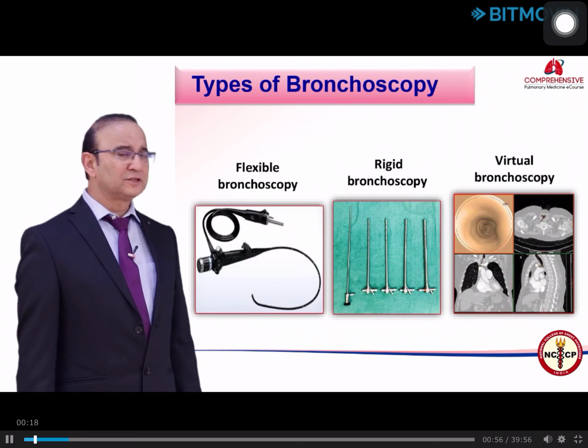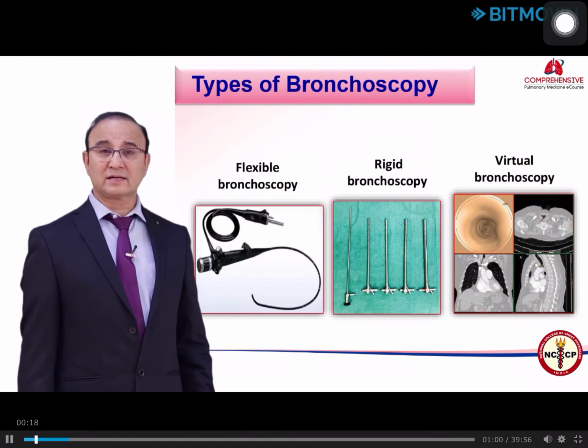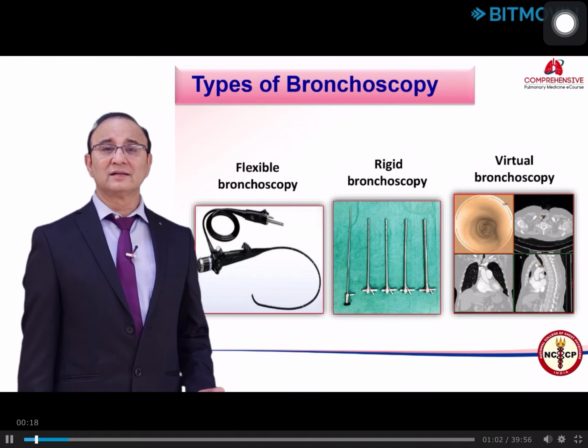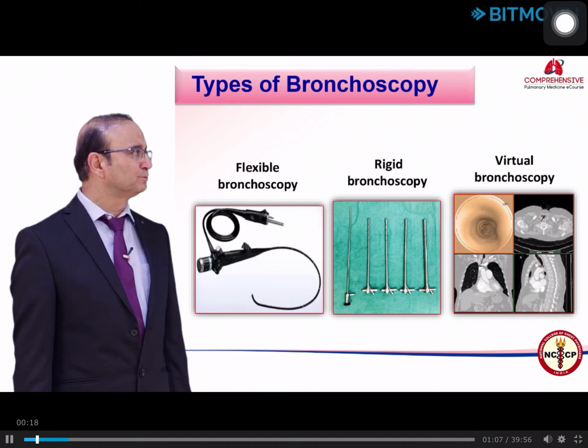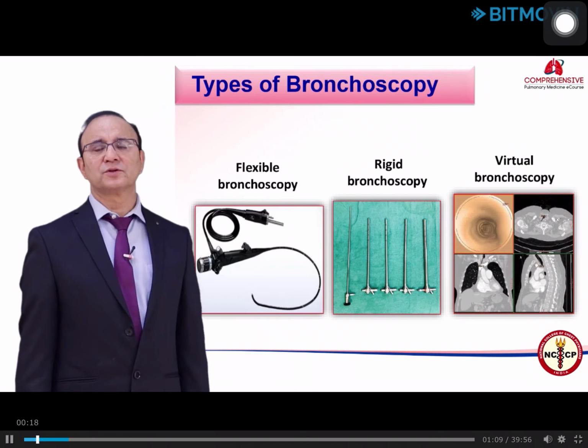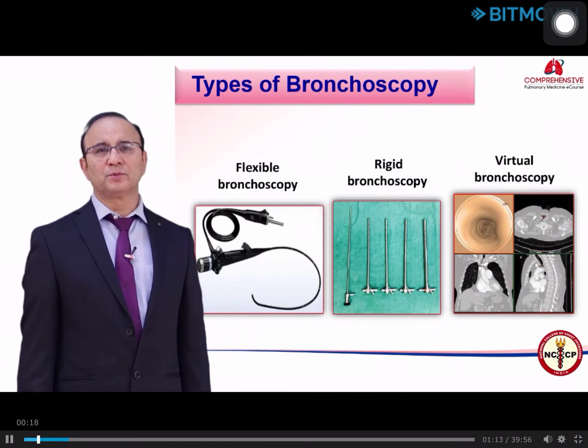The rigid bronchoscopy came into existence long back, and that is still prevalent, and it has re-emerged as a therapeutic scope for most of the procedures. The flexible bronchoscope, which is the commonest bronchoscope used, and the third is virtual bronchoscopy.